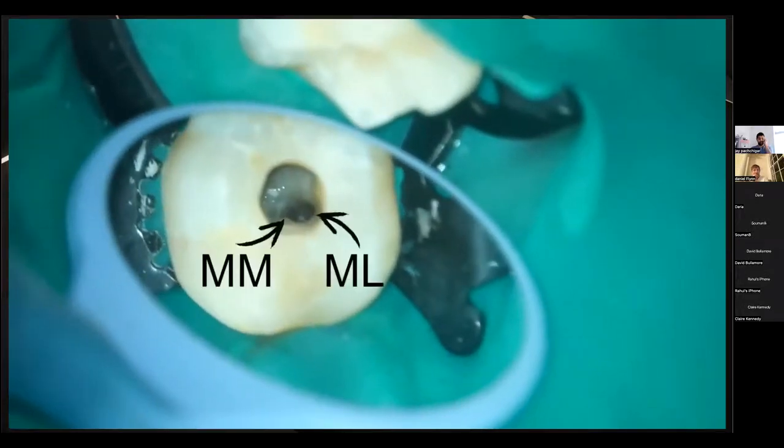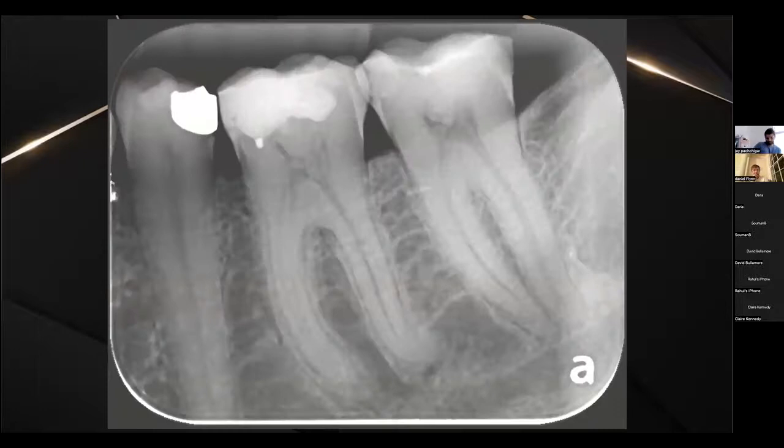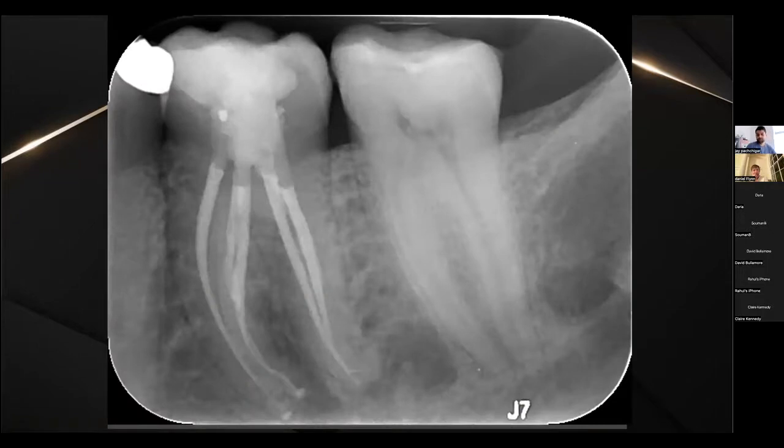So this was another 5 canal lower molar. I thought I had a video for this. Actually, I didn't, but I think I have posted this case on the group. So actually this MB root all the way down here, that was 27 mils. And again, if you're trying to get a warm gutta-percha wave, 27 mils, you're going to be doing quite excessive coronal preps on some of these canals.